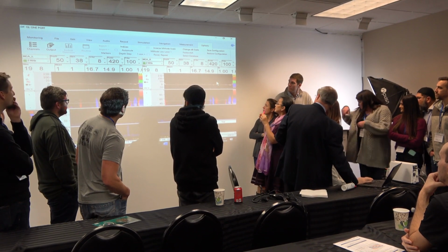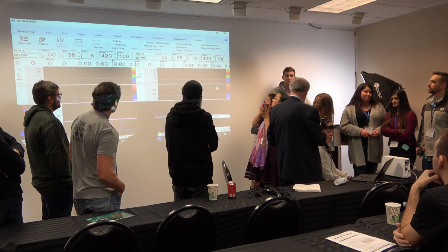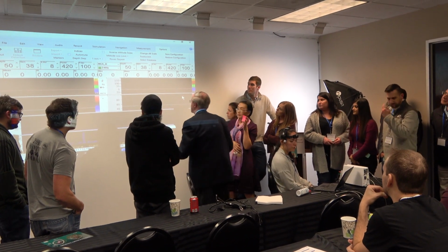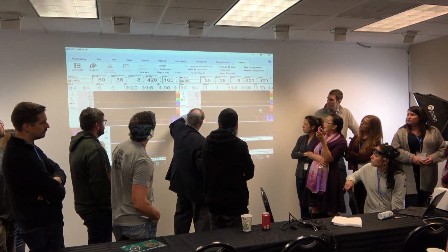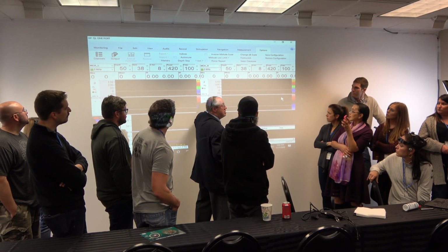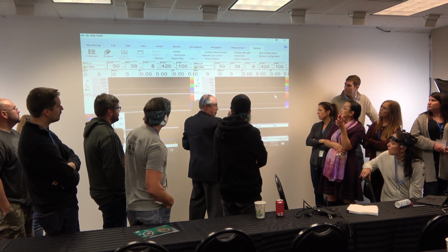At the bottom here, what we are seeing is the so-called power M-mode Doppler. What is the difference between the two of them is the following. The Y-axis here represents flow velocity in centimeters per second. The Y-axis here represents depth of insonation, all right? Of course, the X-axis is time here and there, all right?